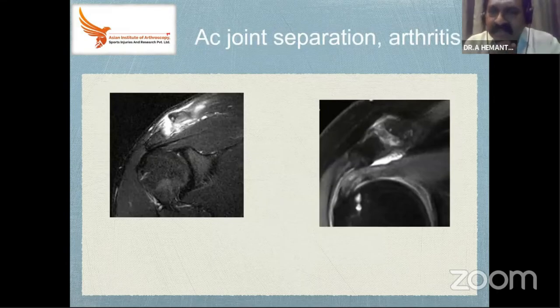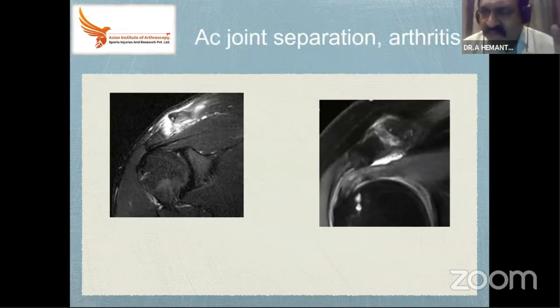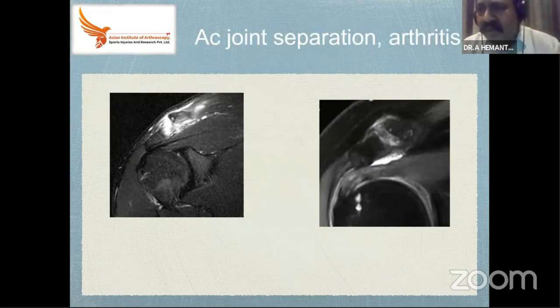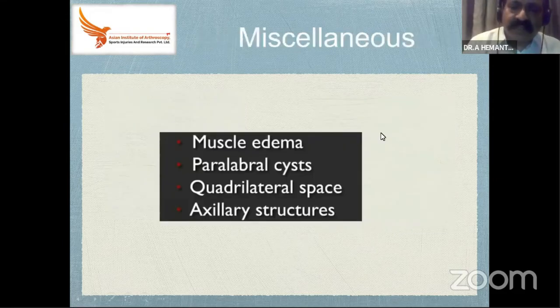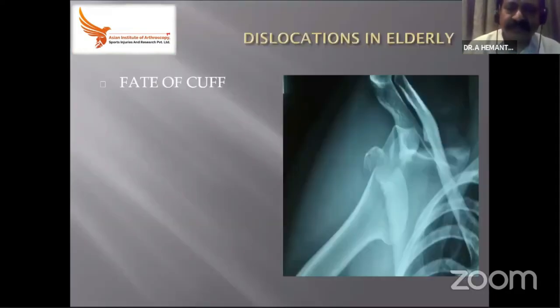What we sometimes miss when reporting an MRI is the AC joint. Pain is mostly during night time and acute localized tenderness can be seen. AC joint separation of mild grades and AC joint arthropathy can also be identified. Miscellaneous structures include muscle edema, paralabral cysts, and axillary structures.